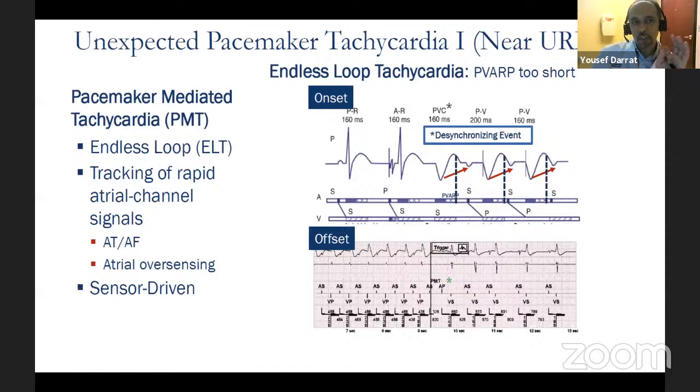So this expert consensus, again, is not based on studies. They say that a patient within 90 days of revascularization who requires non-elective permanent pacing, so it's kind of an urgent pacing, such as complete heart block, would also meet primary prevention criteria for an ICD, and it's still within 90 days, in whom recovery of left ventricular function is uncertain or not expected. Of course, that's obvious, not expected. Implantation of an ICD with properly selected pacing capabilities is recommended. I mean, if someone's EF is 20%, they had an MI less than 90 days ago, and he needs a pacer, so what do you do?